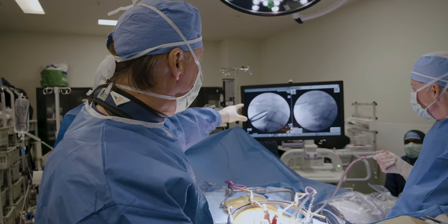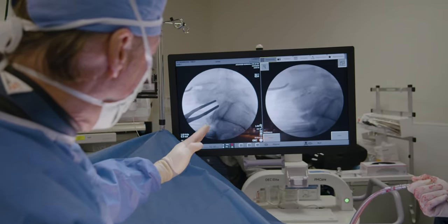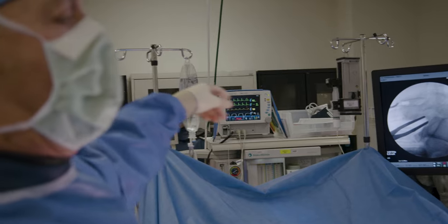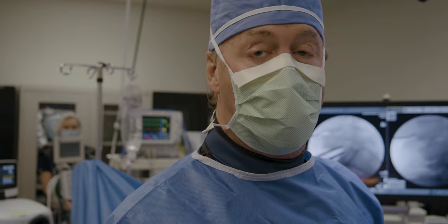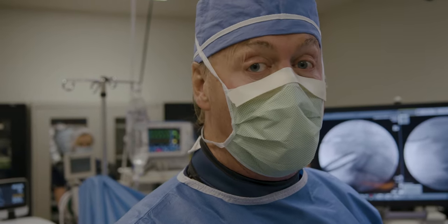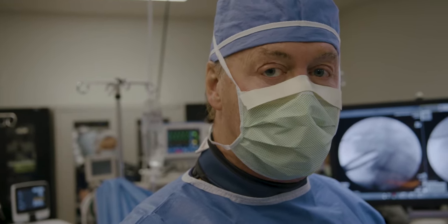You can see now L5 is lifted all the way up — it used to be sitting all the way down and forward. Over there is Elena, and she's monitoring his L5 nerves with motor evoked potential monitoring, continuous monitoring the entire time. She's telling me if I'm over-stretching any nerves. In fact, the signals have improved on the left where he was weaker, so they're getting better — a good sign that I'm not over-distracting or stretching the nerves.